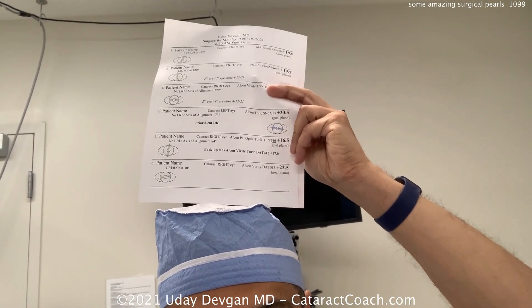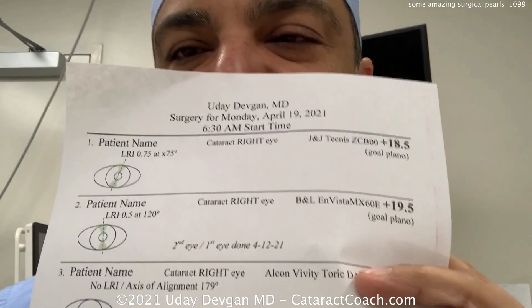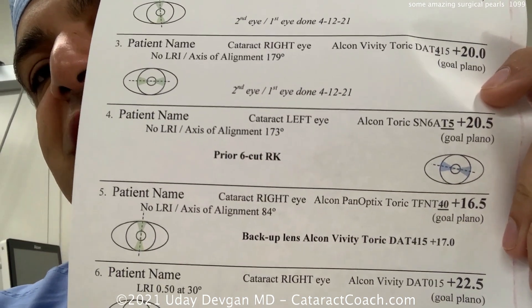Why do I put those pictures that way? Because the right eye diagram is on the side where the patient's right eye is, and left eye entries are where the left eye is. By doing it this way, I'm able to sit here, operate, and know where to make my incisions so as not to intersect the LRIs.